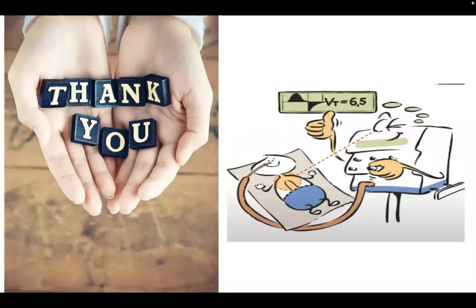No, we don't have any experience, because we are not using cuffed endotracheal tubes in our newborn patients. That is the reason leak is likely to happen, because sometimes we may not be very sure that whatever ET tube we have placed is snugly fitted. It should not be too tight or too loose. If it is too tight, it will cause pressure trauma, and if it is too loose, it will leak.